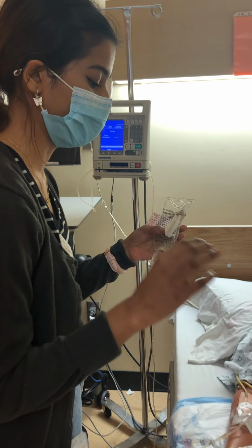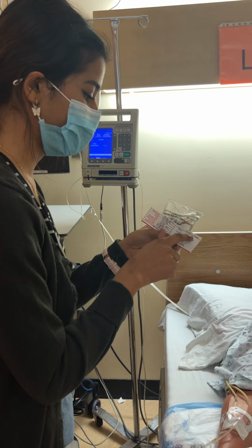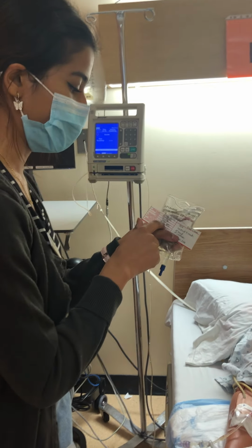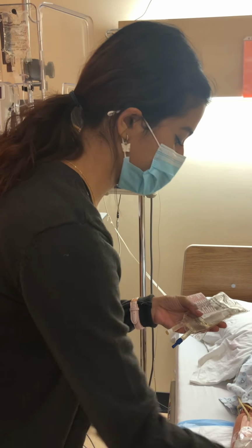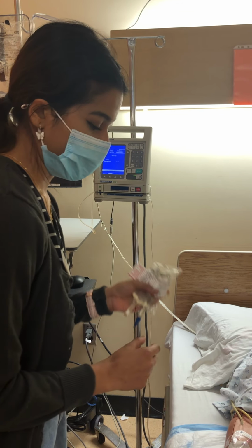So I had a final volume of 5 mLs that I injected into 45 mLs of normal saline to get a final volume of 50 mLs, final concentration of 1 milligram per mL. Right dose is PCA, I have the PCA MAR, I have PCA written on my label, and the right time is today now, so we're going to be going ahead and doing that.